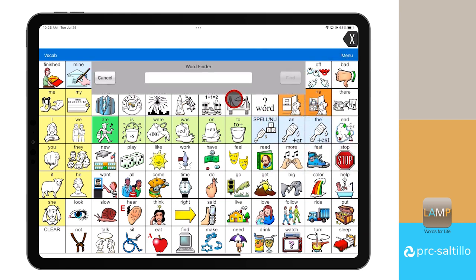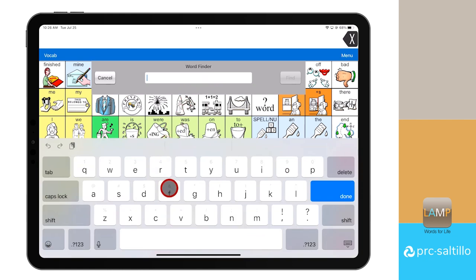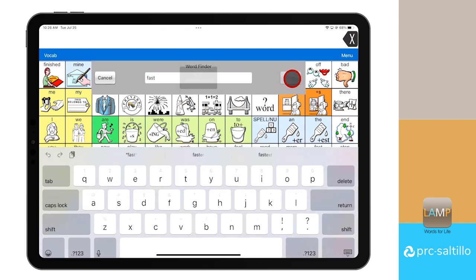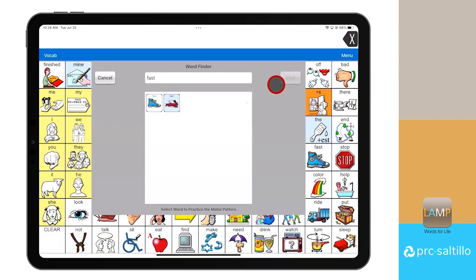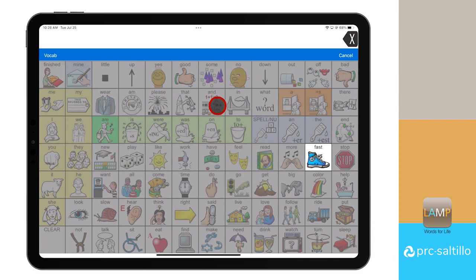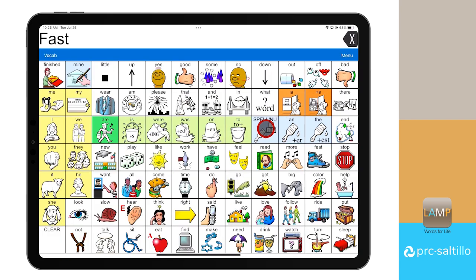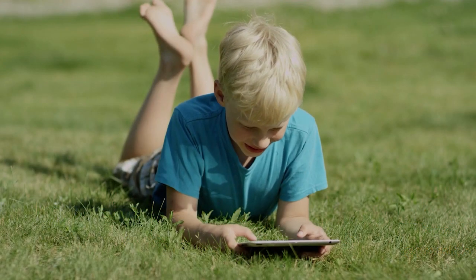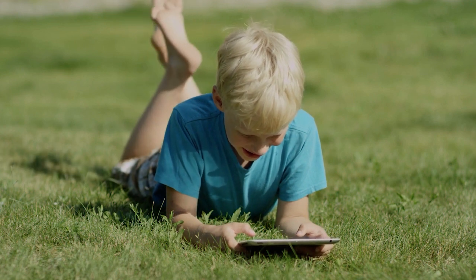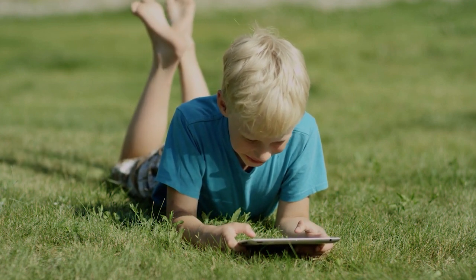Let's find the word fast within our vocabulary. Select the search bar, which will bring up the keyboard. Type the word fast and select find. Once again, select the icon sequence to practice the motor pattern and find the word. Now that you know how to use WordFinder, keep practicing and modeling to learn your vocabulary.